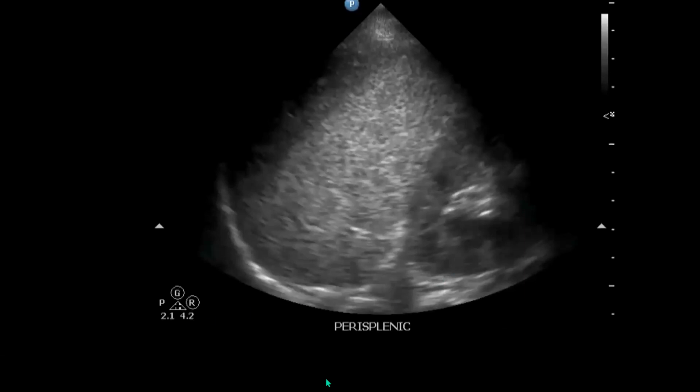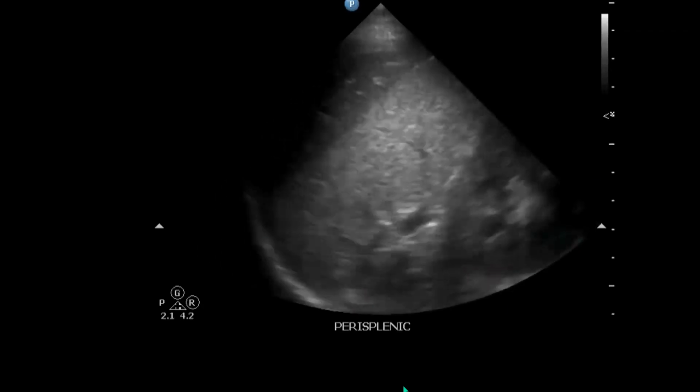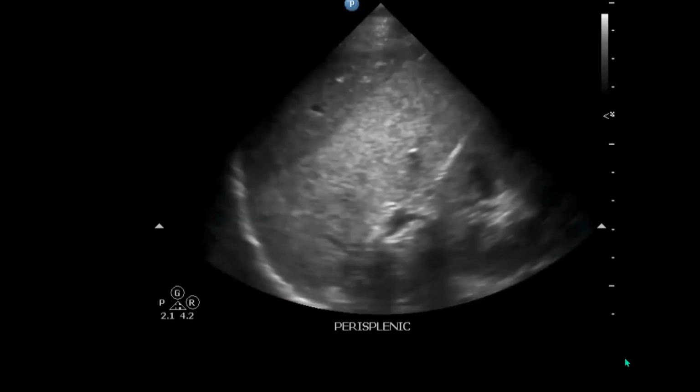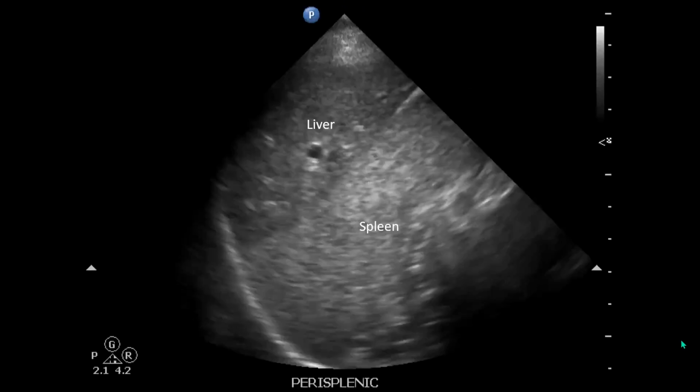Okay, now we're going to test you here. So here's our spleen. Here's our kidney. And then there's something going on up here. And you'll notice that there's more vessels in this. Remember, I had talked about hepatomegaly, and sometimes you can have the liver cross right over on top of the spleen. So this is not some weird bifurcation of the spleen. This is actually the liver crossing over.